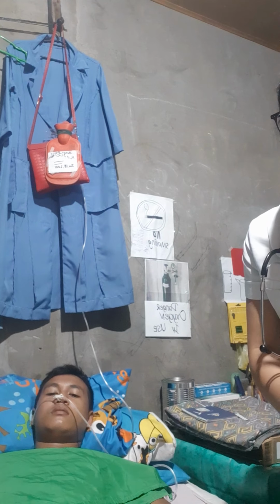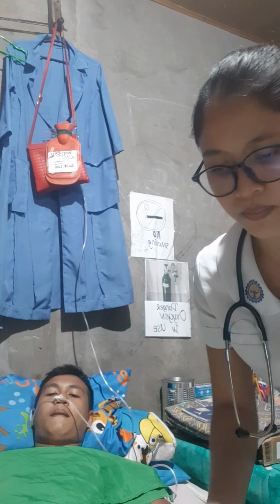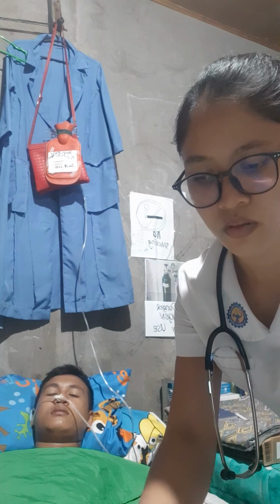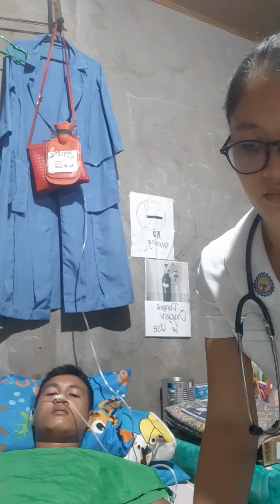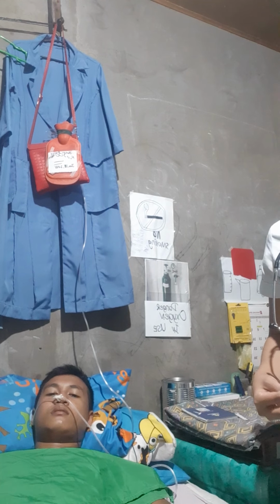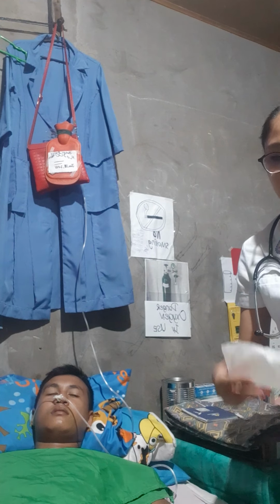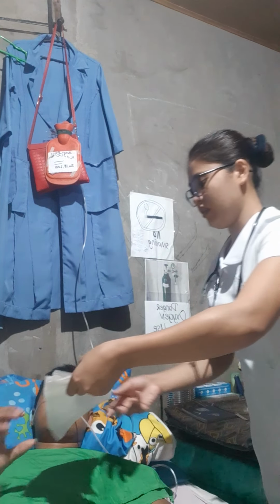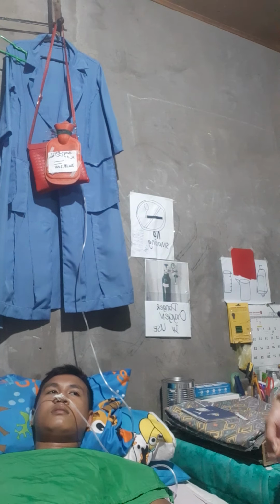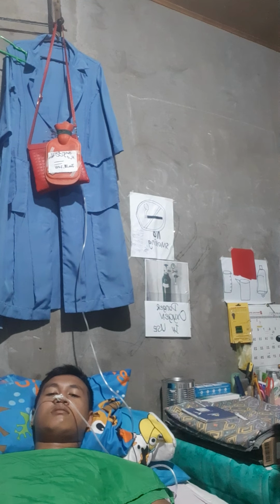This will help the client wipe his mouth and nose later when the tube is removed. Sir, can you hold this one? Later you will wipe your nose and mouth.